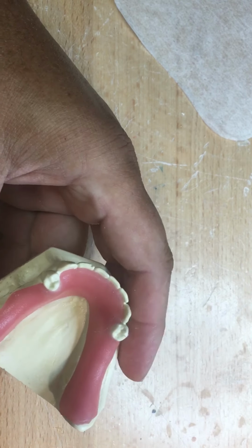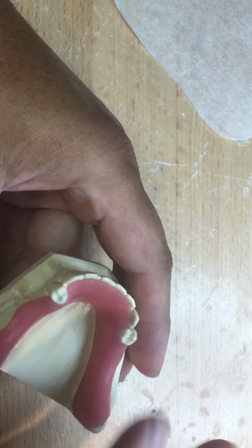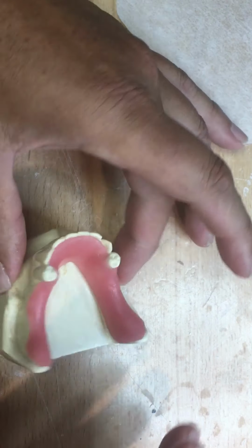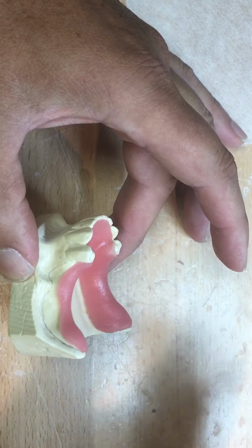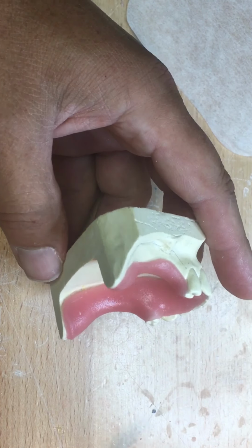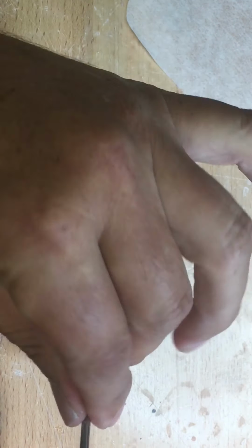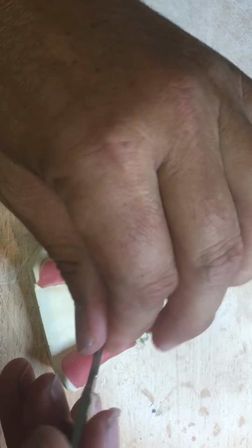So again, in the anterior apron area, it's tapered over the cingulum, approaching the incisal edge. I'm going to go over with my tapered burr to smooth this out. Now, if you feel that these coverages of the retromolar pad are in occlusion from, let's say, a super erupted 8 on the maxillary, then you can cut this short and have it in wax. But I know that the opposing dentition here is going to be a full denture. So I have more room, unless they've got giant tuberosities from an ill-fitting denture over dozens of years.